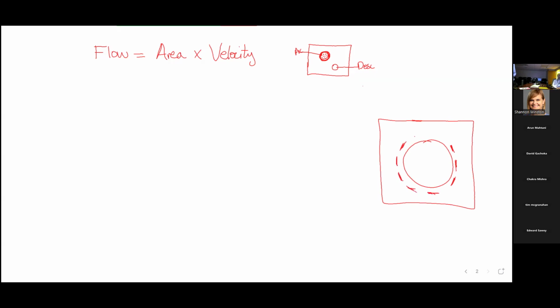What you can do is create a magnetic field gradient so that the magnetic field is low over here and it gets high over here. So high, low. And what's interesting is that when protons move through the magnetic field gradient from low to high, they accumulate what's called a phase shift.